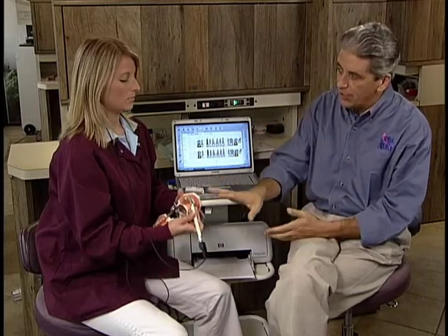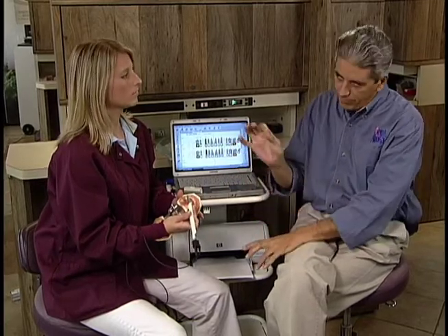Okay? This is visual acuity. I accept wholeheartedly that you're used to probing to tactile feedback. You're used to that traditional probe feeding back to your hands. That's gone with this instrument. It is 15 grams. So that's a little more getting used to in holding that handpiece.